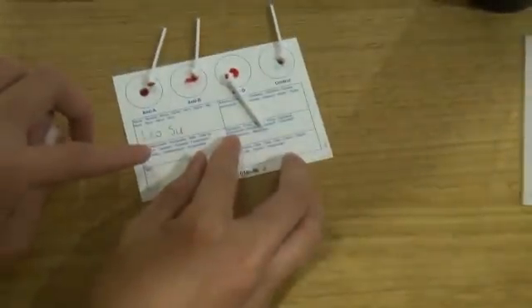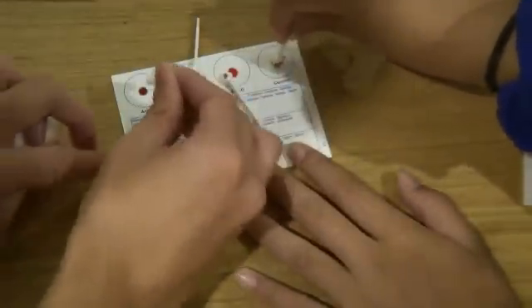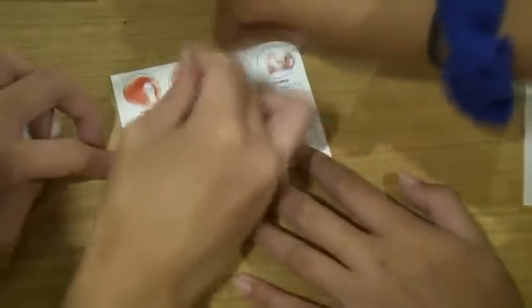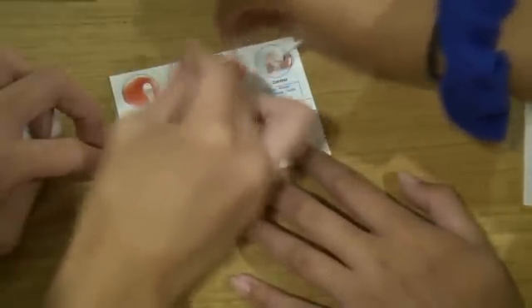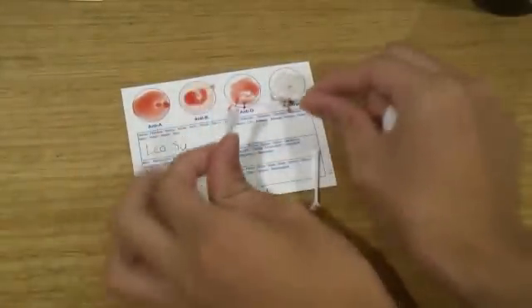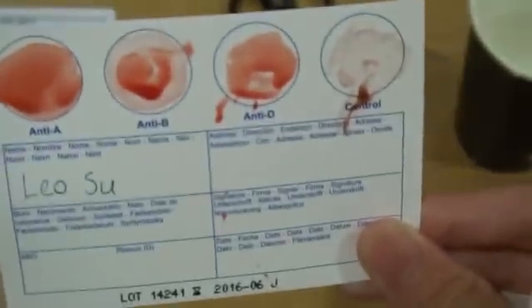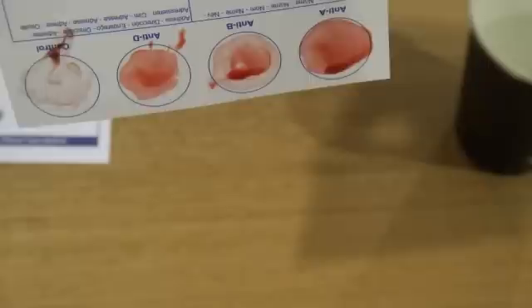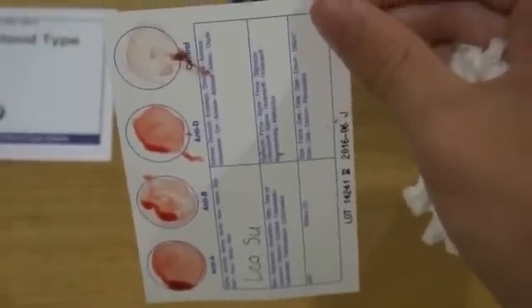And now we start stirring. Stir each circle for 10 seconds. After we have done this, we take the things off and hold it down for 10 seconds. Then we flip it upside down and leave it for 10 seconds, and then we do it right there.